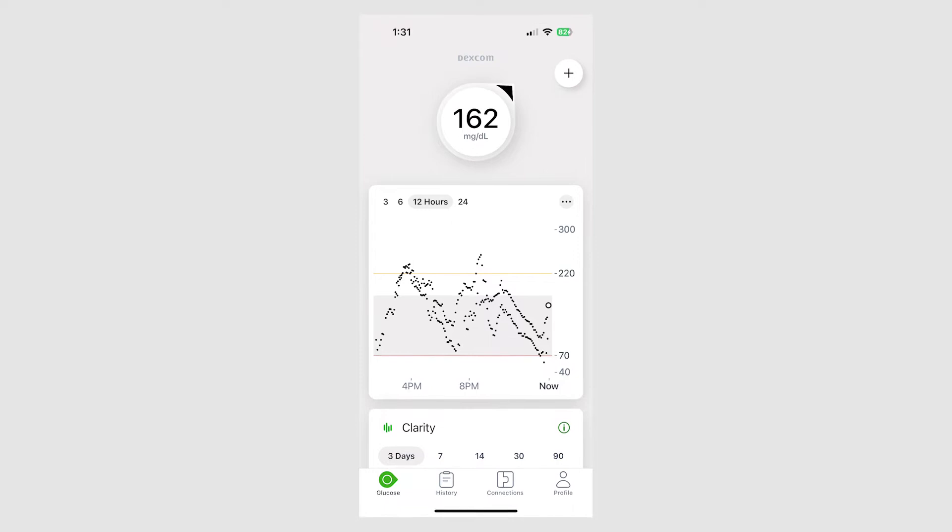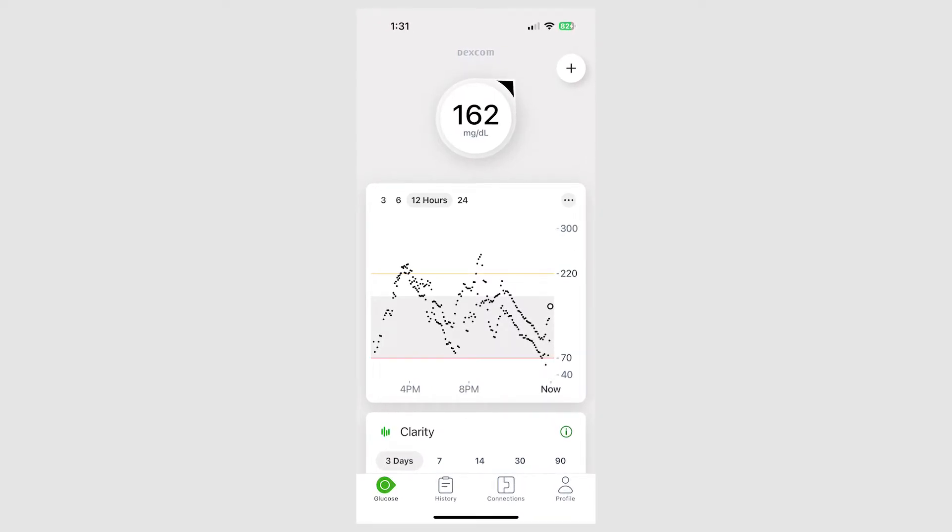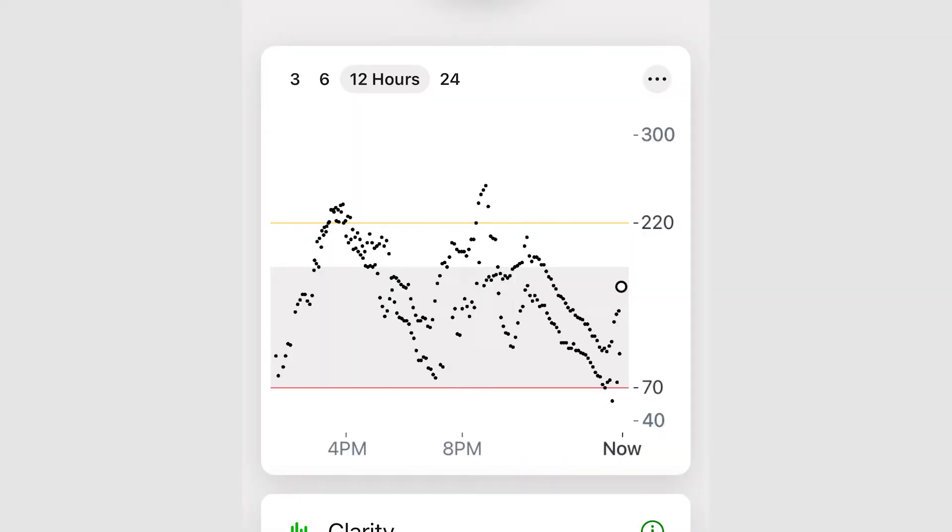I did a whole video on how that works, so I'll link that. Interestingly, because you can stack sensors, there's a glitch that gave me a peek into how consistent and accurate the G7 data is. When you have both sensors on at the same time and you deactivate the older one, you see a graph with the two numbers side by side on the app. The rises and falls are very, very consistent. There may be some difference between the actual readings, but what we're reading these sensors for is to know how quickly we're rising and falling — so our automated systems know how much insulin to give or pull back.